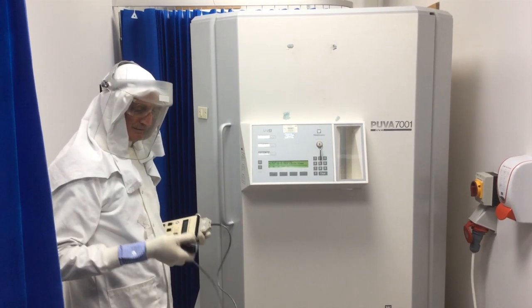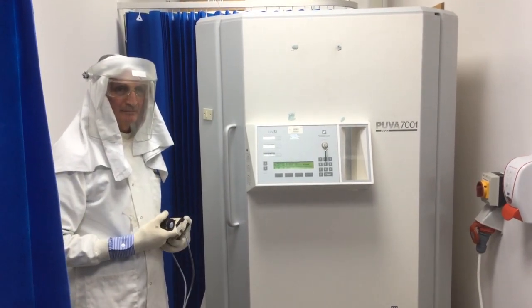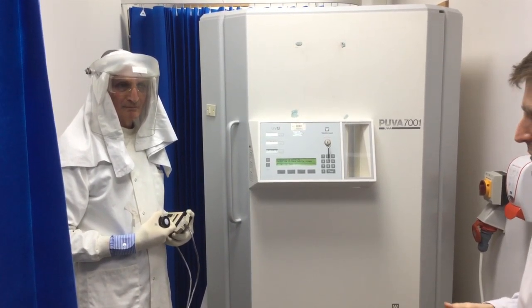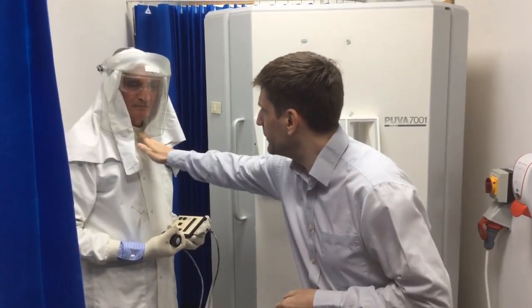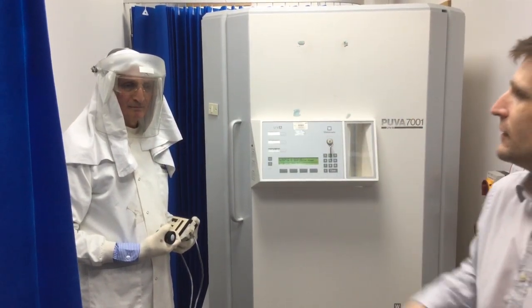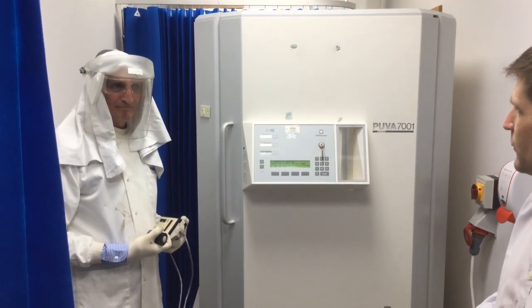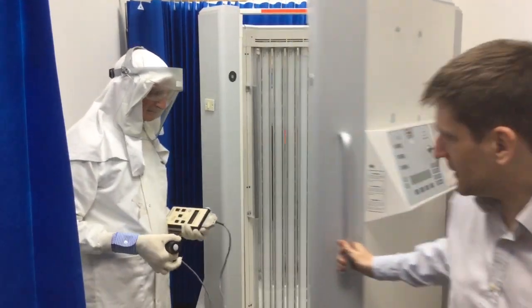We've decided we are going to do the direct measurement and we've got someone properly gowned up. The 8-hour UV dose limit applies to any part of the skin or eyes, so we need to make sure we are properly covered on the arms. The other likely gap is under here, so we've got double protection: eye protection and then a visor covering the face as well. Once we're ready, we open the door and our volunteer steps inside.